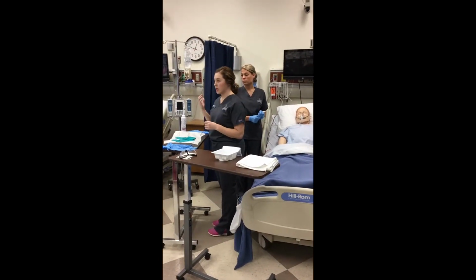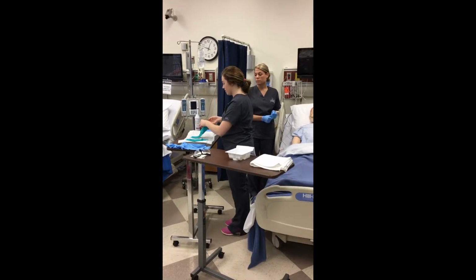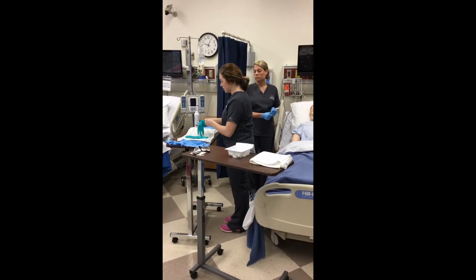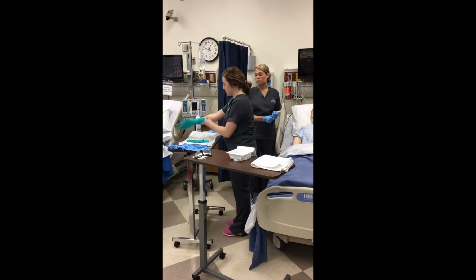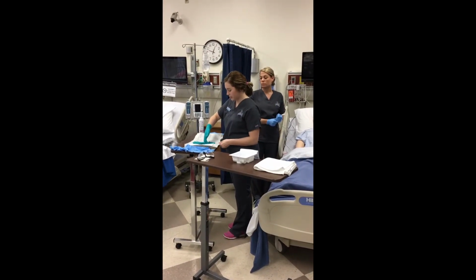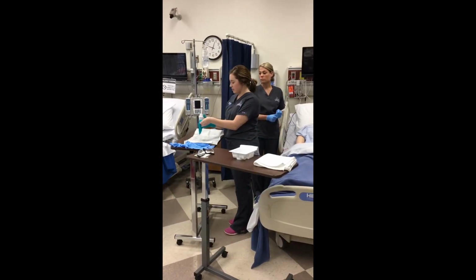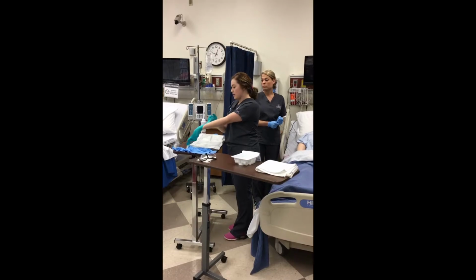I'm going to apply my dominant hand's glove first. I'm going to pinch the inside and slip my hand in. Now with hitchhiker's thumb, I'm going to grab the other glove and slide my hand in.